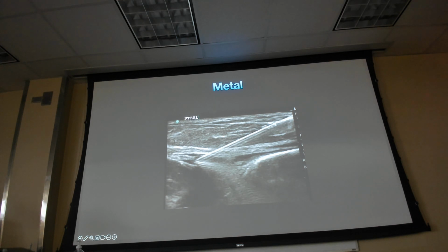Foreign bodies. So we can see foreign bodies on X-rays, right? What kind of foreign bodies can we not see on X-rays? What'd you say? Yeah, we can see glass. It should be radio opaque. But wood, organic materials, you're absolutely correct. We cannot see anything organic. So if they have a giant thorn or a splinter or a piece of wood, we usually can't see it. Or a tree branch, we probably wouldn't be able to see it because it's wood.